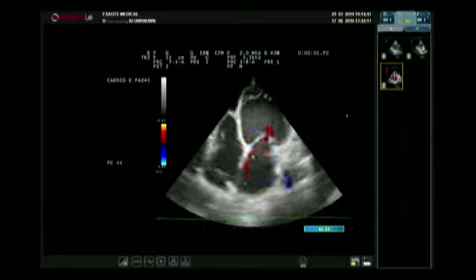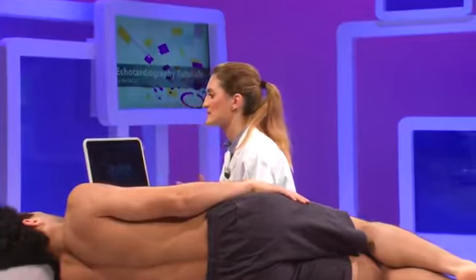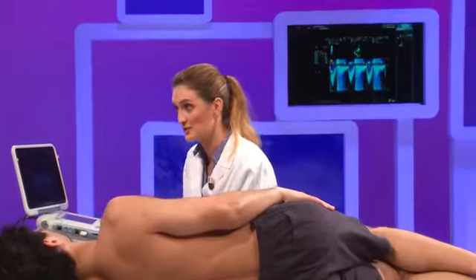The possibility to use more quantitative parameters of assessing valves, such as, for instance, the PISA method for mitral regurgitation, depends on how stable your patient is and how much time you have, and also on patient's conditions, because it is likely that your patient, if he is significantly ill and very symptomatic, cannot easily take the left decubitus.